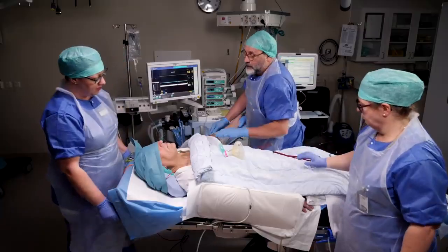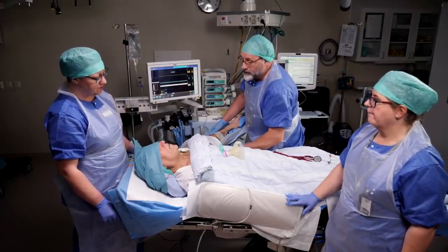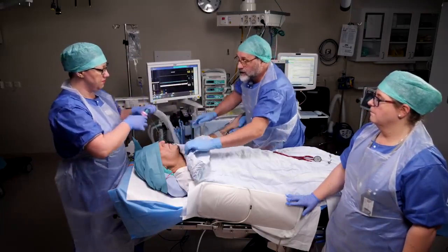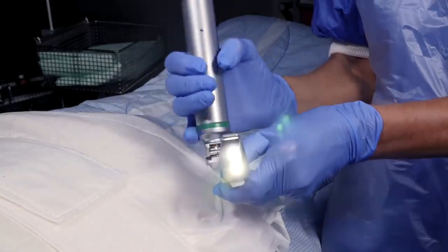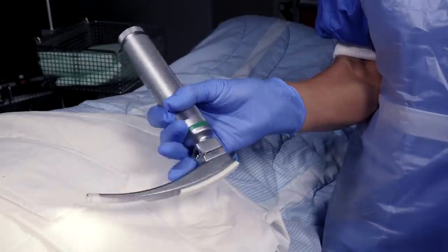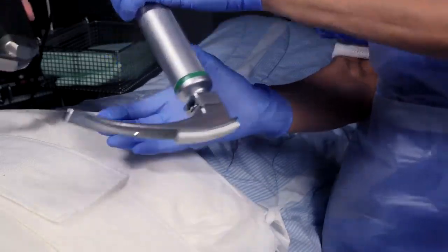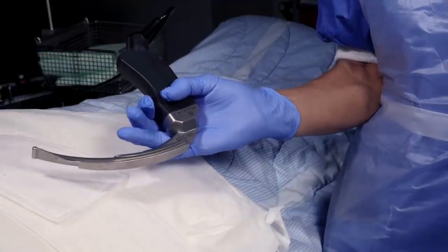Your goal is to achieve a line of sight to the vocal cords in order to pass the tube through them into the trachea. This requires a laryngoscope. We will teach the traditional direct laryngoscopy, but for filming purposes we use a video laryngoscope that has the same shape.